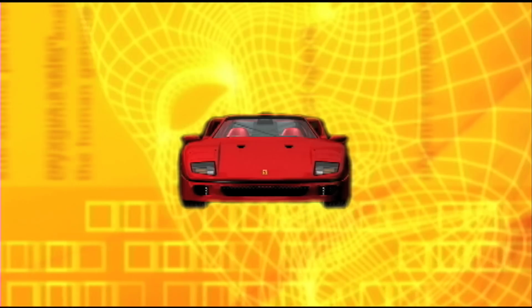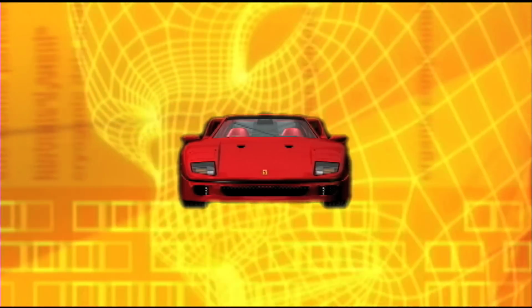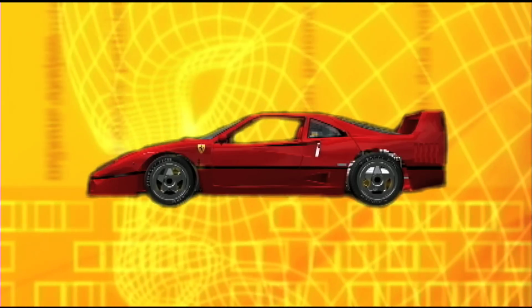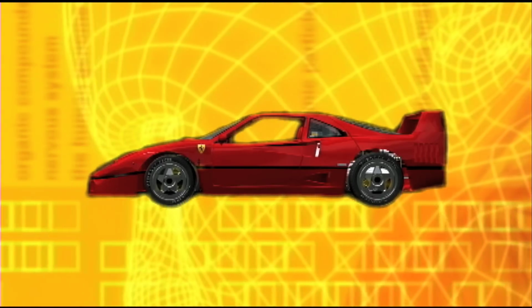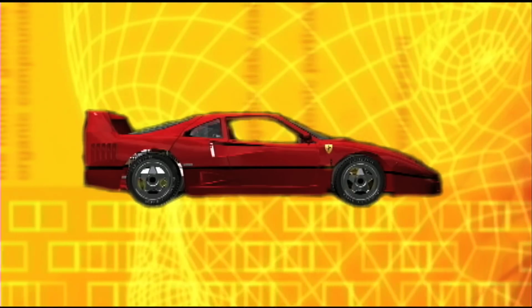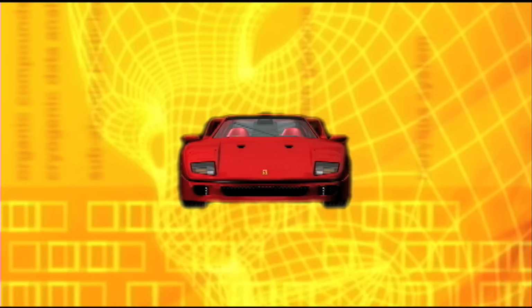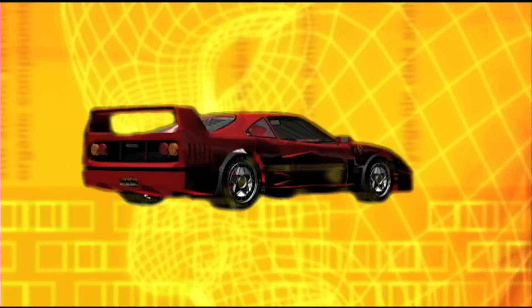And I would equate this to multiple views of any 3D object, such as this computer-generated automobile. From the front, we can say that this vehicle is a red sports car. As we rotate to the side, we glean more information, noting that it's a two-door with chrome rims. The back displays red and yellow lights, and the final rotation to the opposite side gives us a fairly complete picture of the object as a whole. So the more projections we take around the car, the more information we can determine about the vehicle itself.